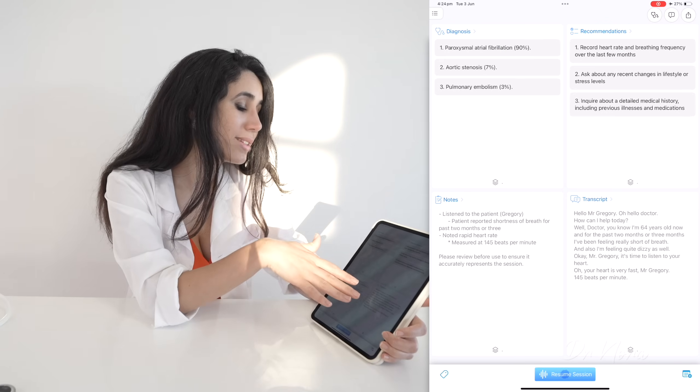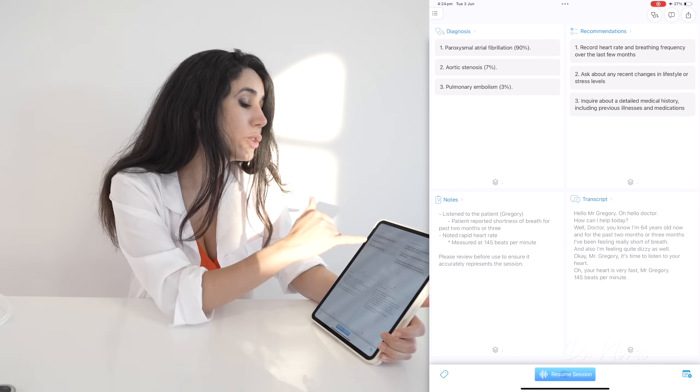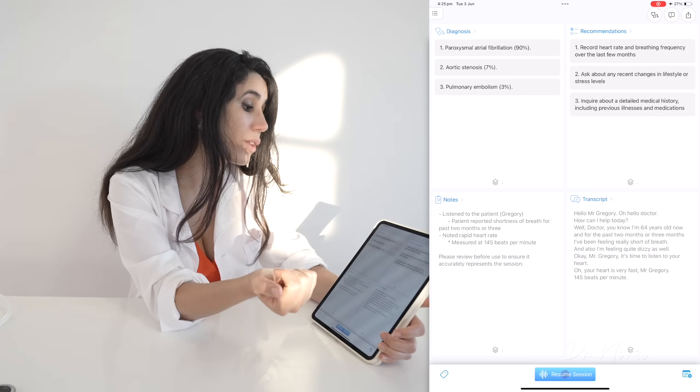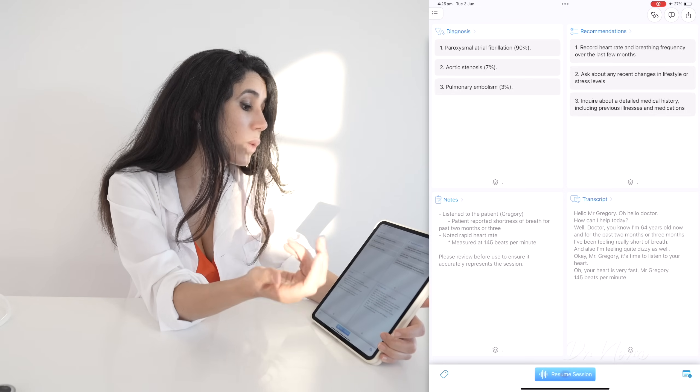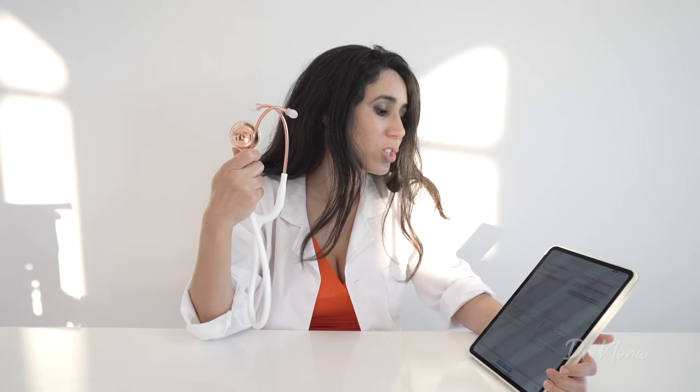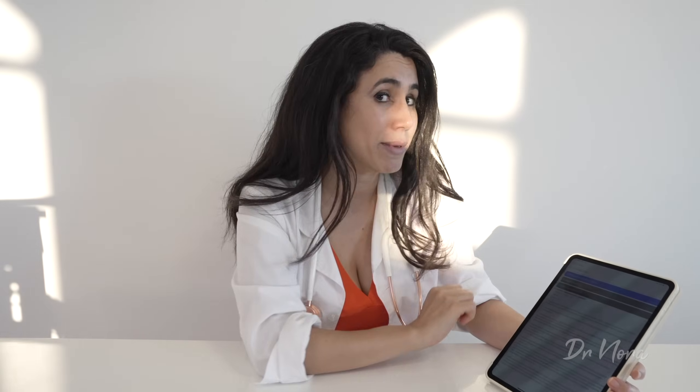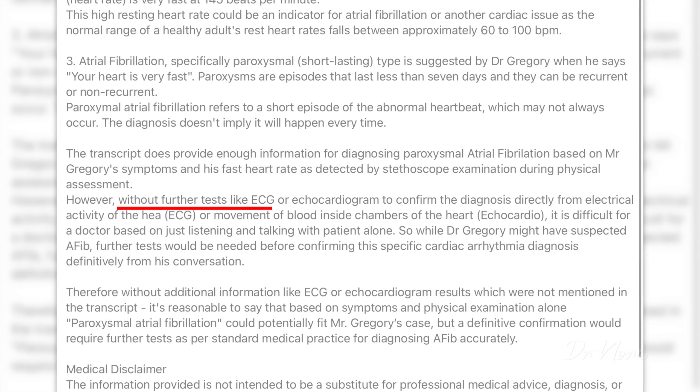On the front page it also gives recommendations I could follow as a doctor — for example, record the heart rate, ask for any recent changes in lifestyle, and inquire about any previous medical history. That's quite impressive that it's changed its differential diagnosis just from sensor information from our stethoscope. As a GP, I would never diagnose atrial fibrillation just from dizziness, shortness of breath, and a fast heart rate. We would do a full history, full clinical examination, an ECG, and an echocardiogram — which, notably, the AI itself advises.